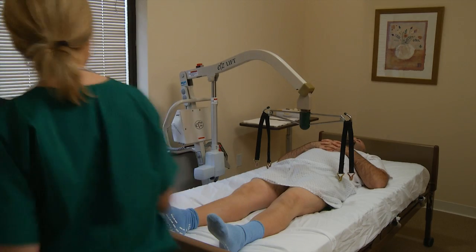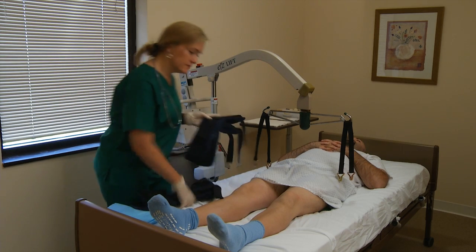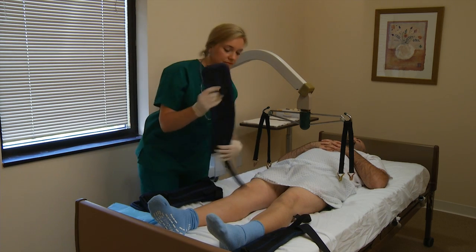The caregiver will need two sets of straps for the double strap process. One set will be attached above the knee, as in the basic process. The other set will be attached over the calf, below the knee.